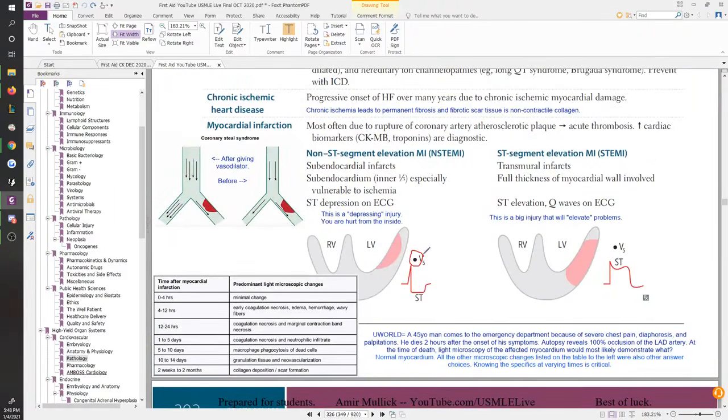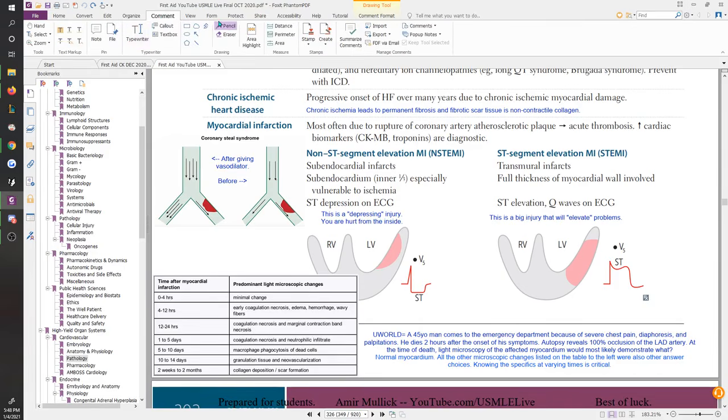They tell you you're supposed to look for it in V5, but you can really see it in many different complexes, not just V5. But here you see ST depression, right? The ST segment is lower than the general baseline. I'm going to show you the baseline on the other full ECGs, but the baseline is basically right where the QRS started, right? So that's your general baseline, and this is below the baseline, right? That's what you're looking for. Same thing here, you have your baseline, and your ST segment is above the baseline, so that's ST elevation.